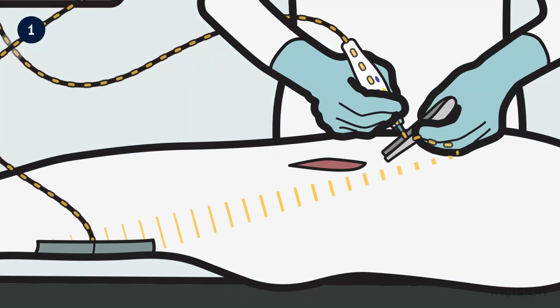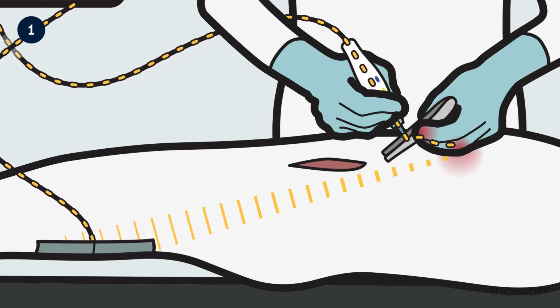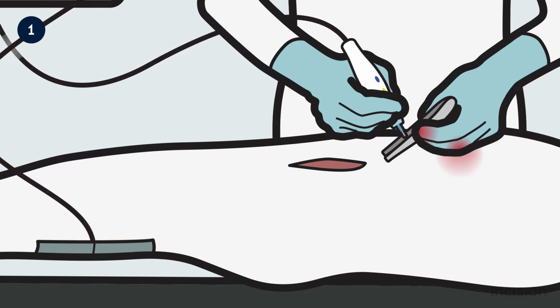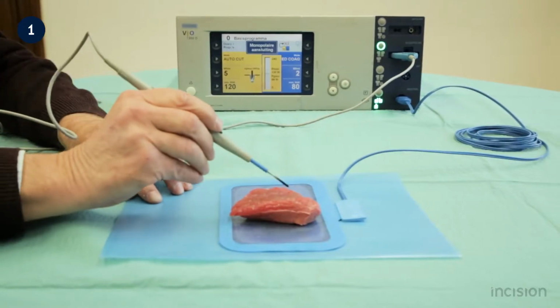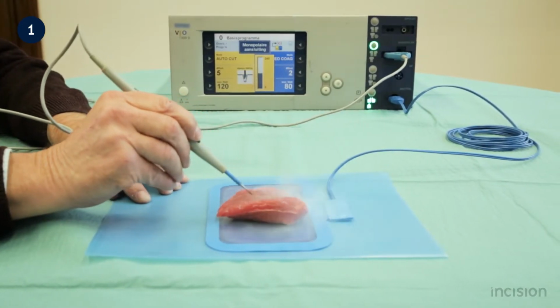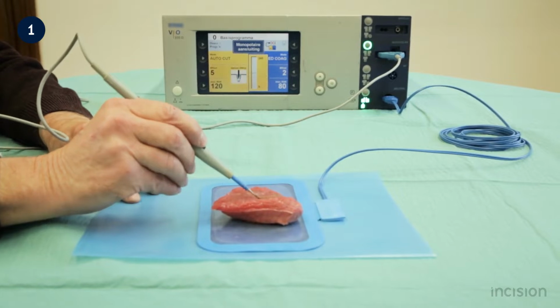Still, there are a lot of hazards that may occur when using it, and every year many patients and healthcare practitioners are injured needlessly by electrosurgical equipment. These injuries are almost always caused by user error and a general lack of understanding, and not equipment failure. By understanding the functioning of the specific generator, the best surgical effect can be obtained, and side effects can be avoided. Electrosurgery is a complex technology that is often not well understood by clinicians. This course aims to change this.